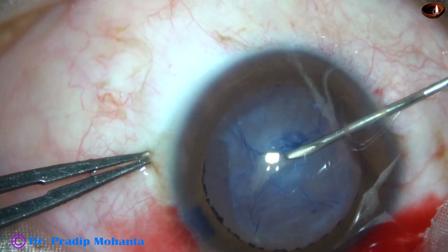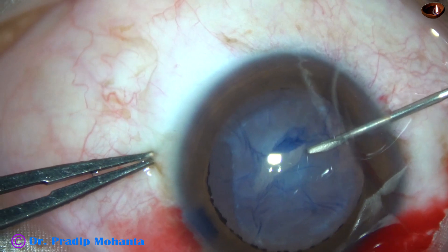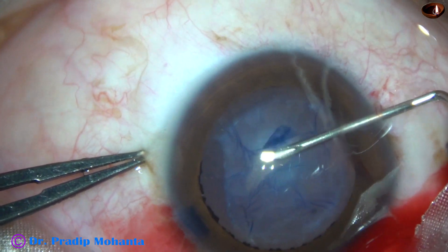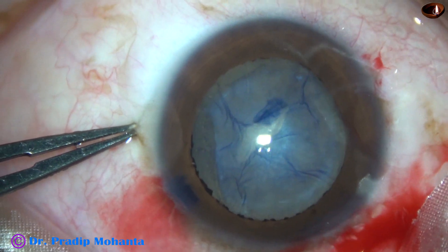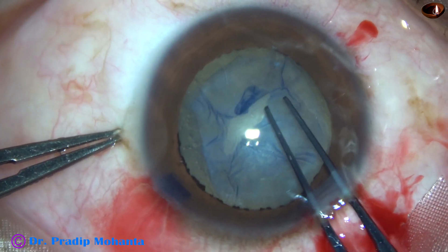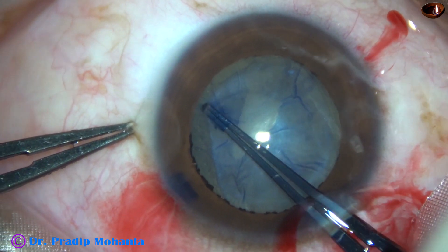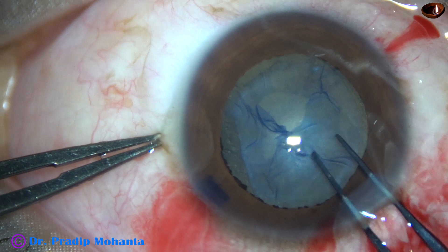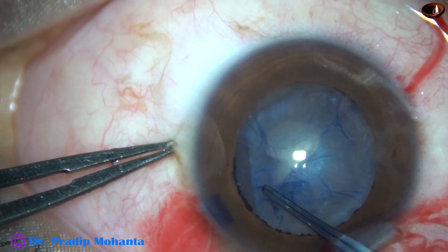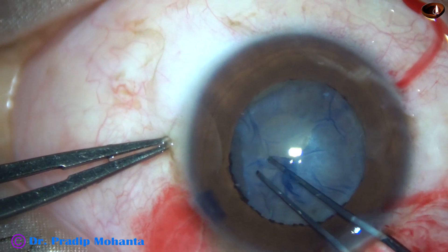I did not know that this could be tried, and thanks to Dr. Bharti Megur, who posted a video where he did this kind of surgery — the removal of the subcapsular fibrous sheet and doing a rexis, a smaller rexis than the fibrous sheet.